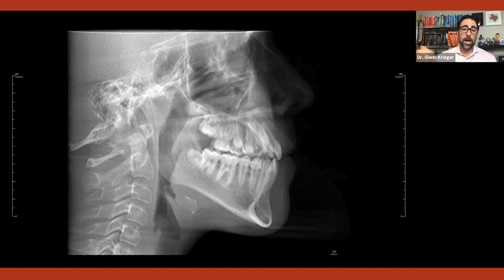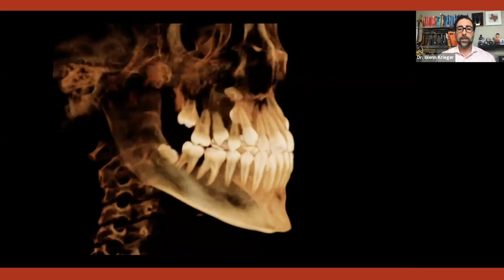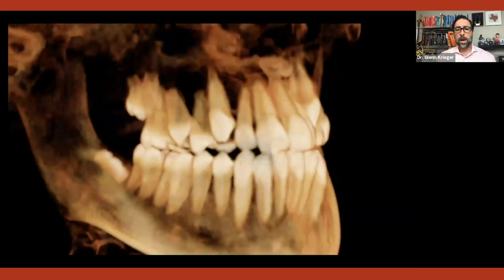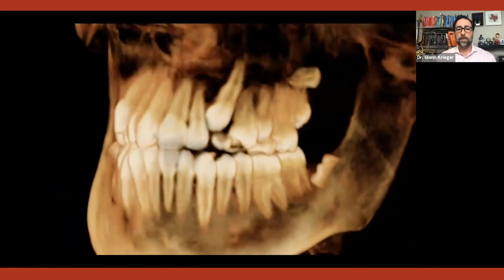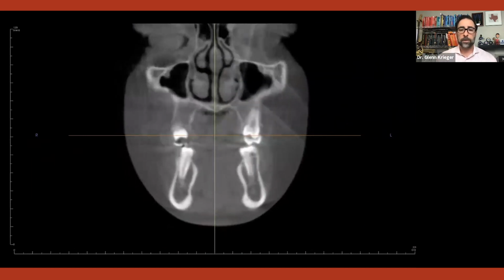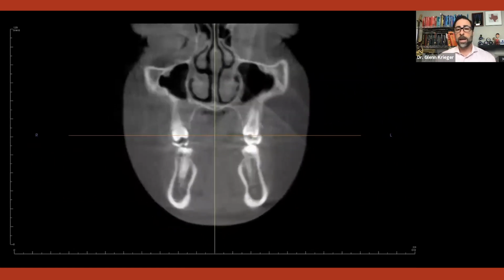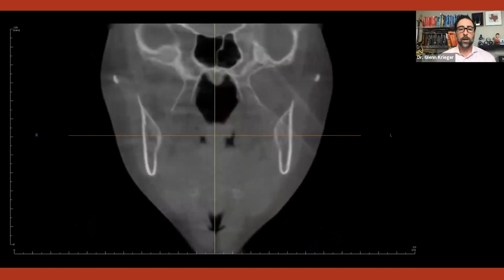And I just felt like, you know, I'll be absolutely fine working without a CBCT for the rest of my career. And so that very case, or if you look at where we're looking on this particular one, and again, it's a different case, my point is, for my ability to look at a case and zoom in and see it from every dimension, to be able to look at it from different perspectives, to allow me to look at the nasal floor, the teeth, the bone and widths from all three planes. You can look at axial, sagittal, coronal, however you want to look at things.